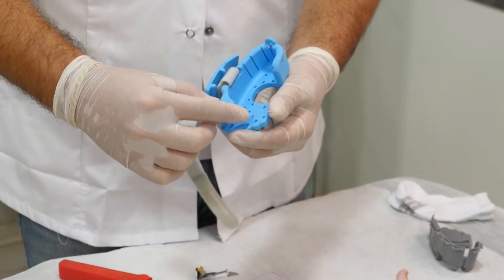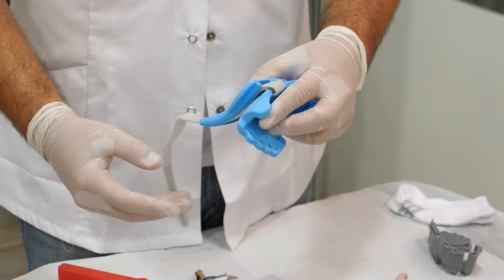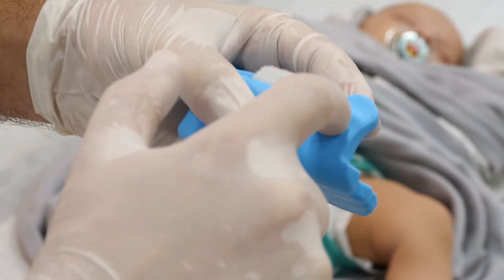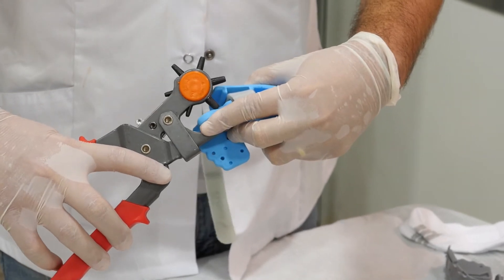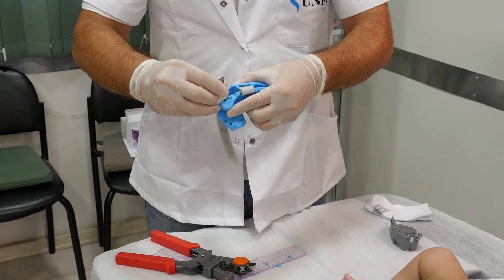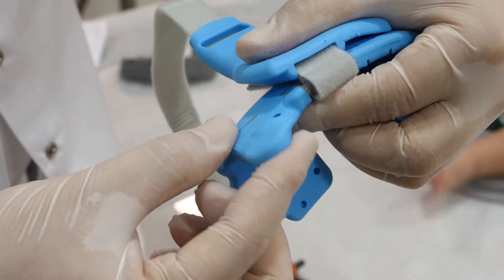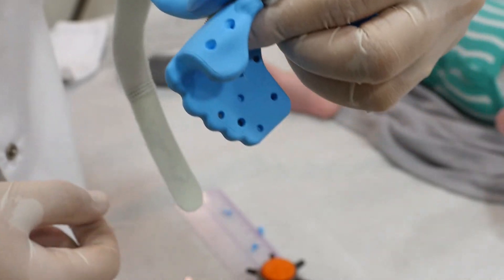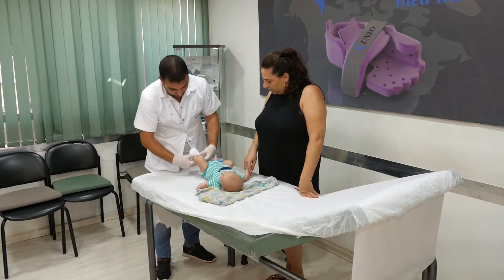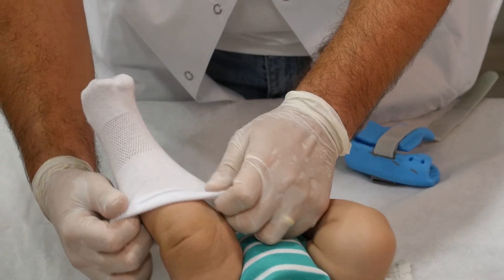Another possible adjustment is releasing pressure from the toe. If the baby's toe is inclined upwards, the pressure on it must be released by making two holes in the soft area on top of the rigid area in the toe fastener, and making a cut to connect the holes. Before the Unfoe brace is installed on the baby's foot, a sock must be worn. It's very important for the sock to be 100% cotton, tight, and fold-free.